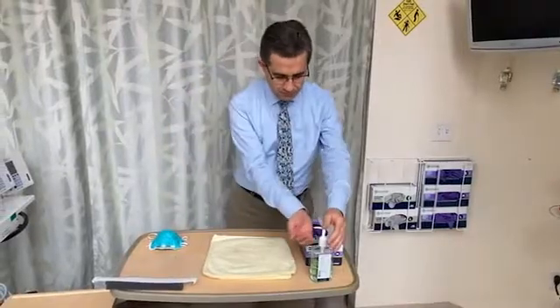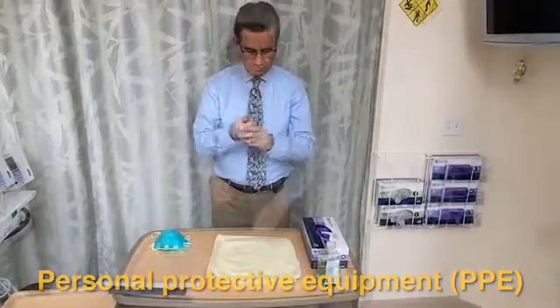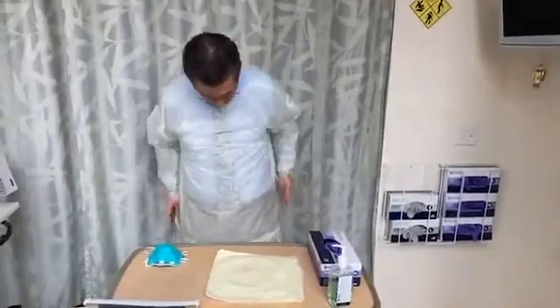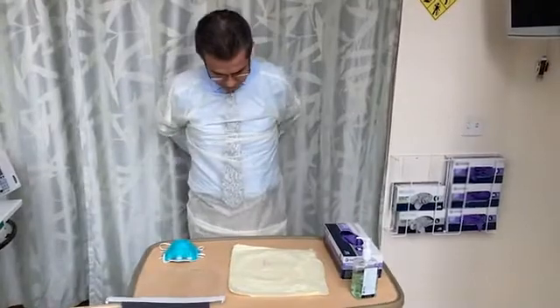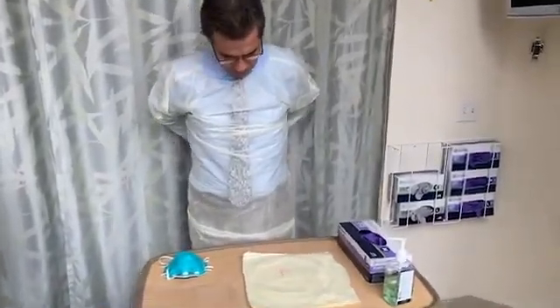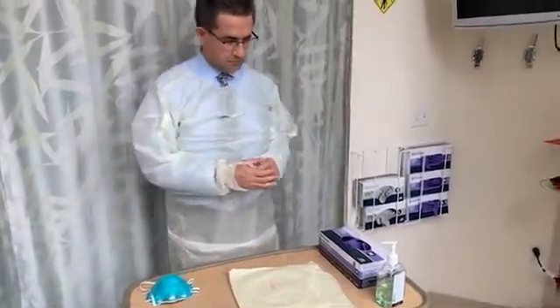It is essential to put on personal protective equipment, or PPE, correctly, and to follow the pertinent respiratory and contact precautions according to both the Centers for Disease Control and Prevention, or CDC, and by your institution. If possible, you should put on and take off PPE in the presence of an observer to make sure that there are no breaks in technique that may pose a risk of contamination.